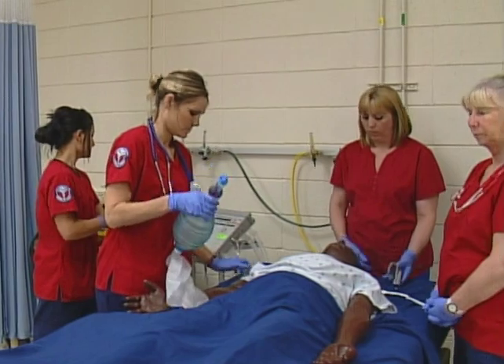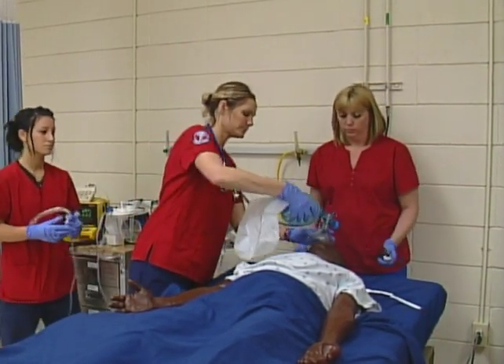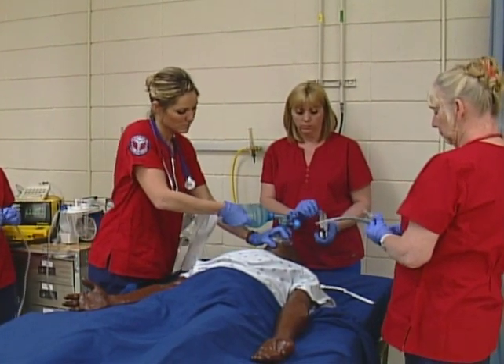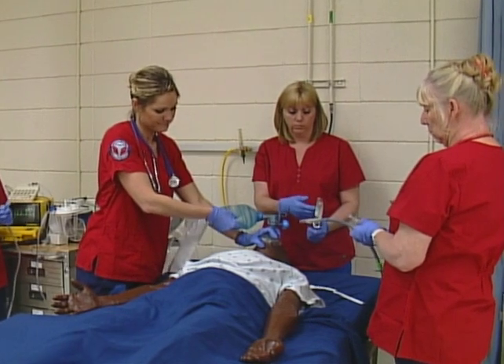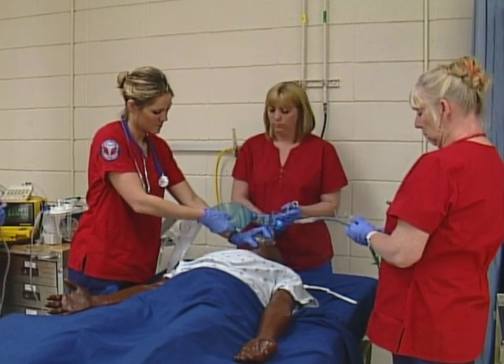A lot of preparation as far as equipment goes into doing this process. Currently, Bobby's doing bag mask ventilation. She's providing oxygenation to this patient. Just enough, not too much, not too little. See a lot of preparatory action by the support staff around her.